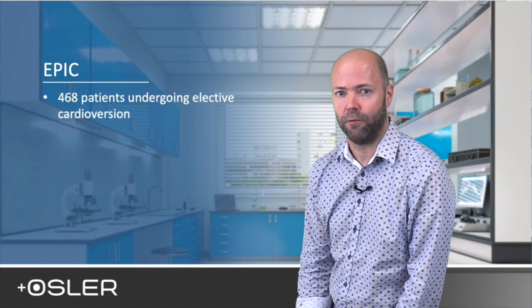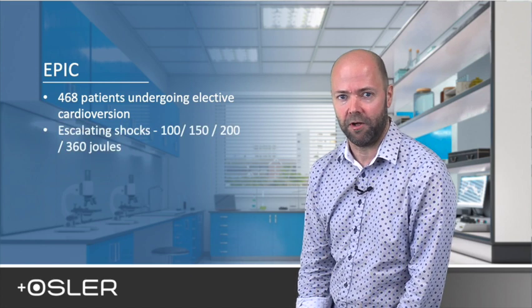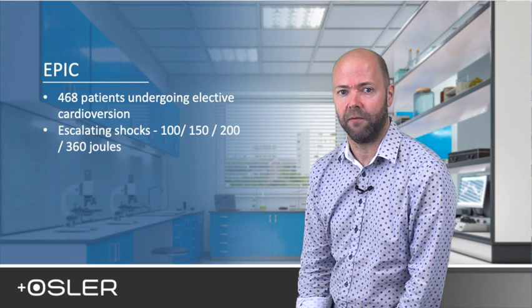The EPIC trial sought to resolve the issue by randomising 468 patients who required elective cardioversion for atrial fibrillation. Up to 4 synchronised shocks were delivered in an escalating manner from 100 to 360 joules.